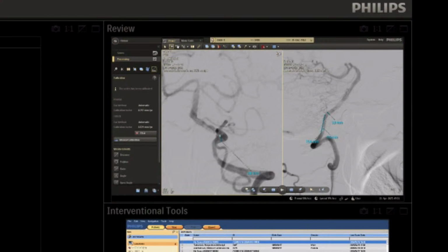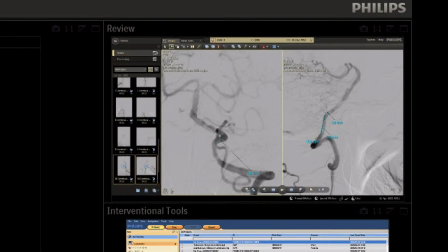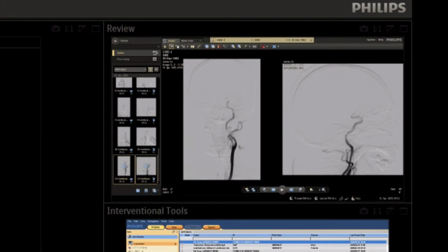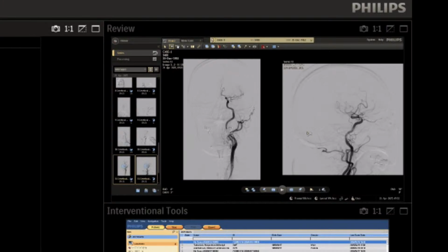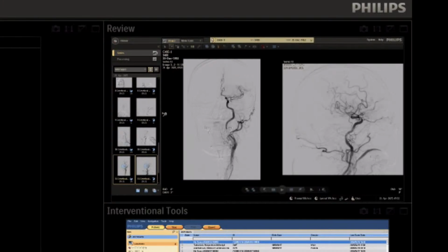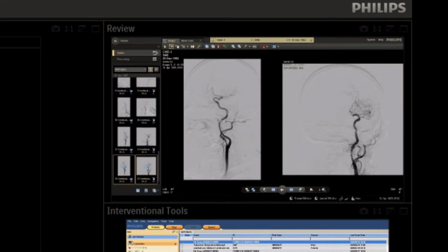275 stent should be better, but now we are very short from the instruments, and there is no PCOM on both sides, and it looks like cortical collaterals is present, and there is a filling from cortical collaterals, the occipital lobe and the temporal lobes. Okay. Dawlet made an oblique view. Now I will ask him to put the guiding in the right vertebral.